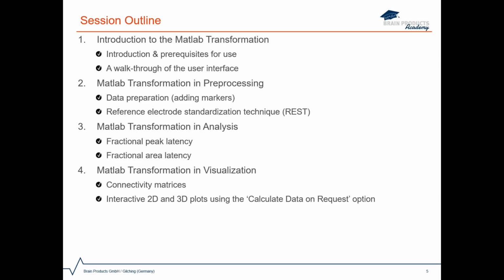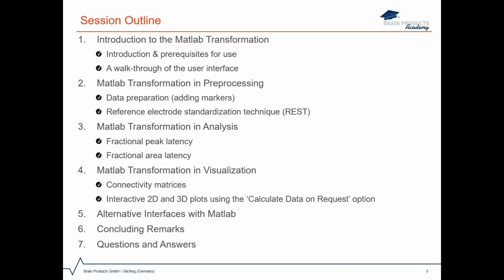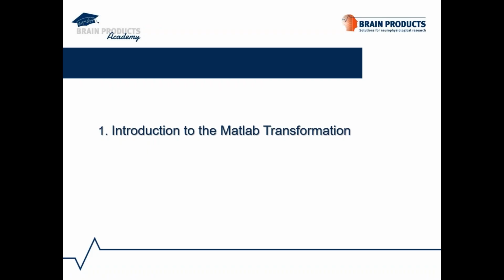A brief background information on the methods will be given. After that, I will mention some alternative interfaces with Matlab, mainly about exporting and importing data. Then I will conclude the presentation and provide some important take-home messages. At the end of the session, there will be time for questions and answers. Without further ado, let's start the journey.